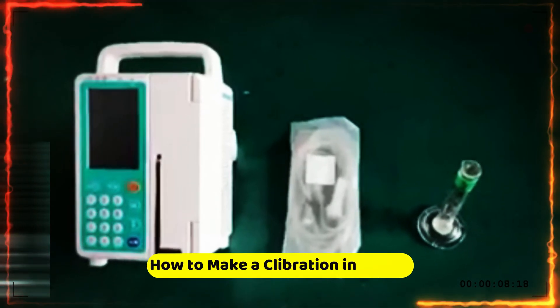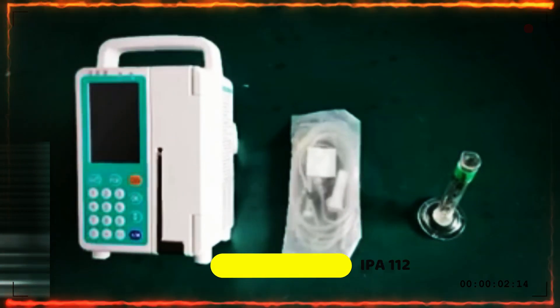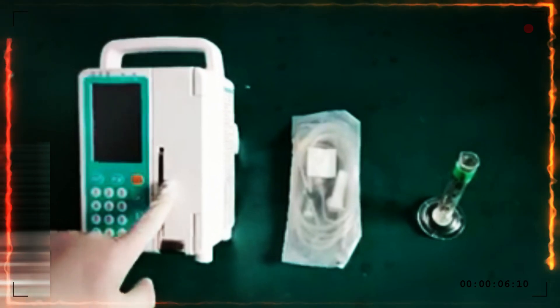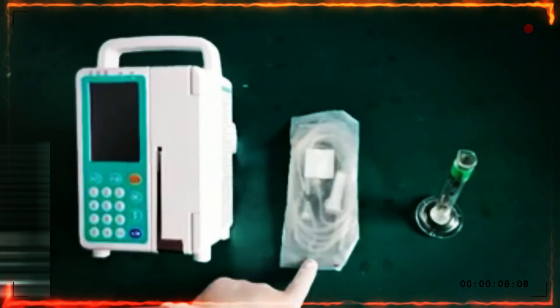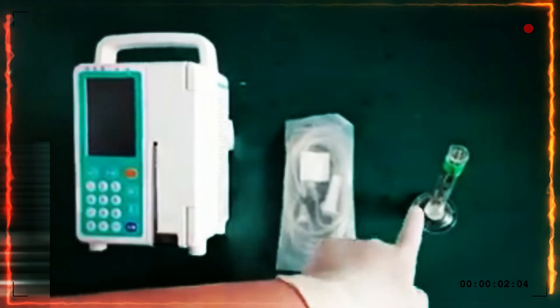In this video, I'll show you how to make the calibration for the infusion pump. First, prepare the infusion pump, the IV set which needs to be calibrated, and a cylinder.